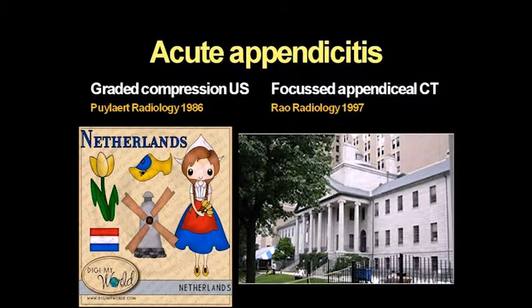Later on, it was found that sometimes the indication wasn't all that clear for appendicitis. They may have had a pyelonephritis or appendicitis, so we extended the scan to the whole abdomen rather than do a couple of slices to the right lower quadrant. And we started using it for inflammatory bowel disease, even non-specific abdominal pain, and sometimes I see scans being performed for what turn out to be constipation.